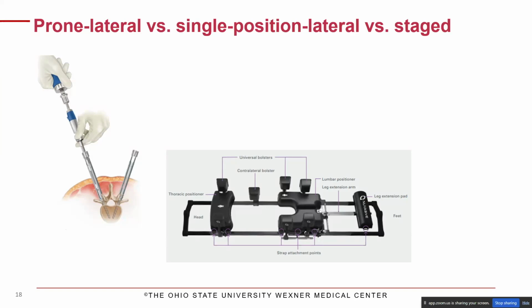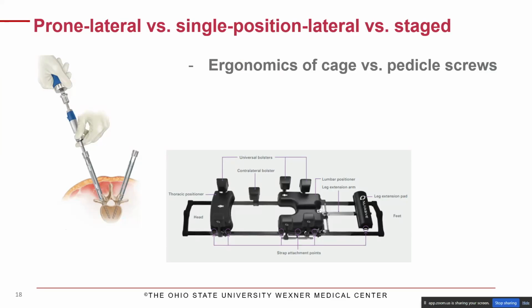That said, the ergonomics for placement of the actual cage is less optimal. But we're going to talk a little bit about how, at least in my practice, I mitigate that.